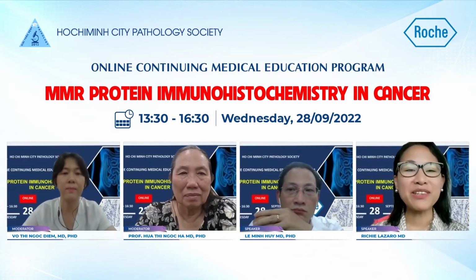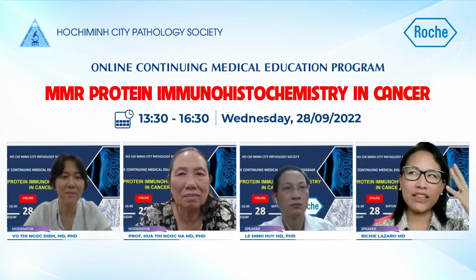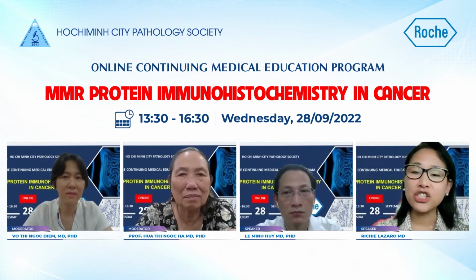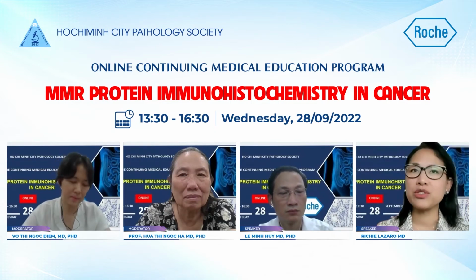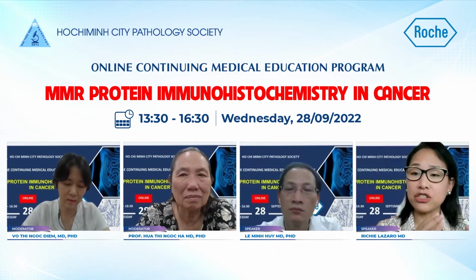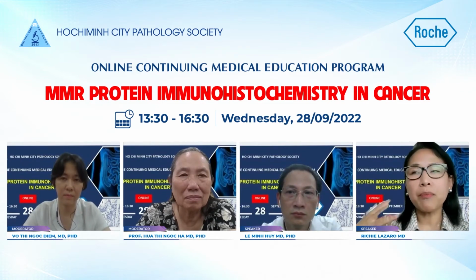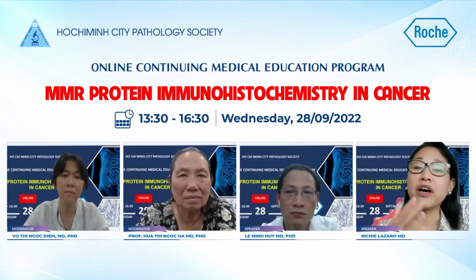Well, by the way, I want to add to the number 3 question. One thing pathologists have to remember when it comes to decisions on assay, whether it's immunohistochemistry or PCR, for example, and we have limited tissue, we discuss with the oncologist. And depending on the patient, will the patient be amenable to another biopsy?